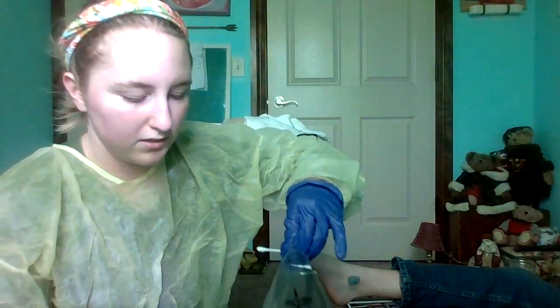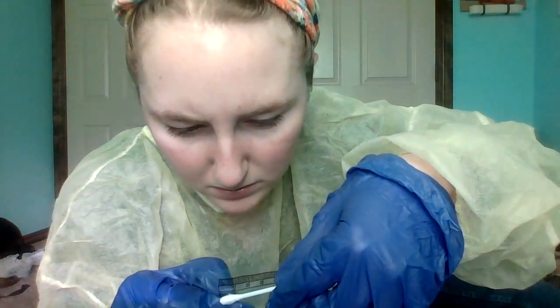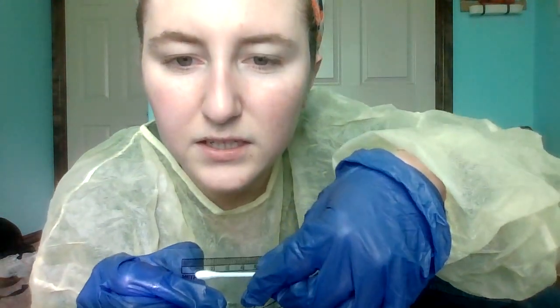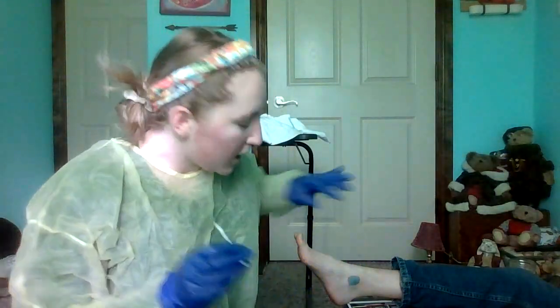Alrighty, and then I'll hold that up to you so you can see it. It's probably about, I'd say 4 centimeters. Can you see that? Yeah. So 4 centimeters is going to be the length, and then the width is across. Find the widest part across. You can see that. I would give that about 2. So the length is 4 centimeters, the width is 2 centimeters, and our depth, we don't really have the depth. We'll go with 0.1 centimeters.